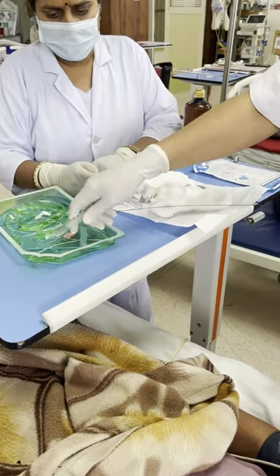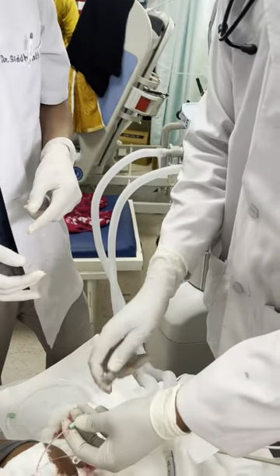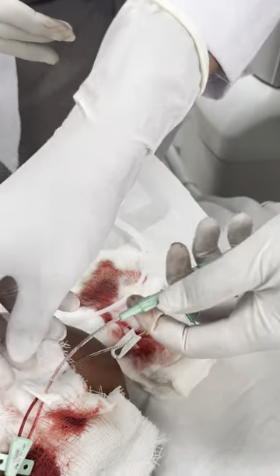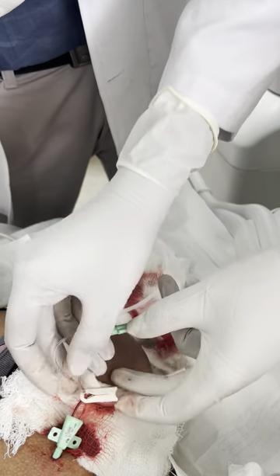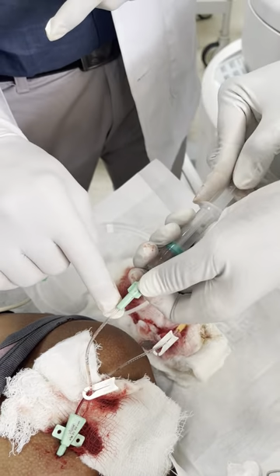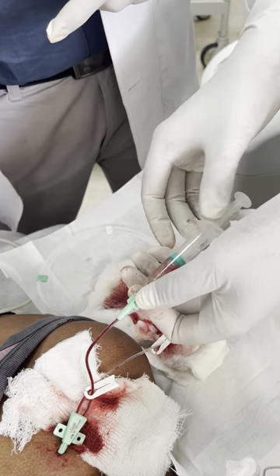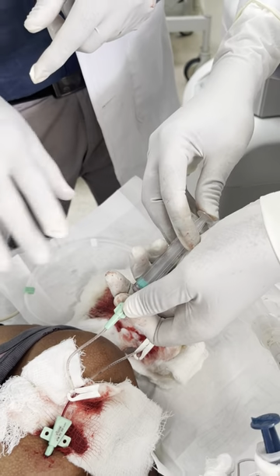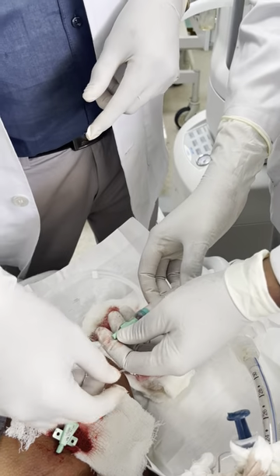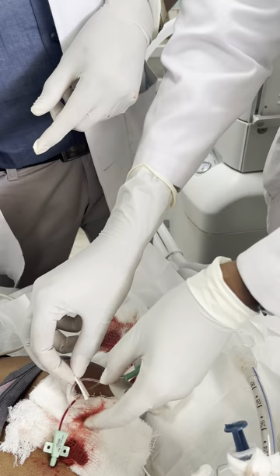Never go dry. Okay. Now what will you do? You will open this. You will draw the blood out of this, but up to here only. Bas. Push back. Push back. Okay. Now air is going. Now lock it first, then remove the syringe.